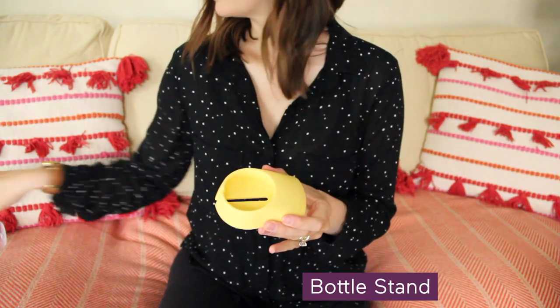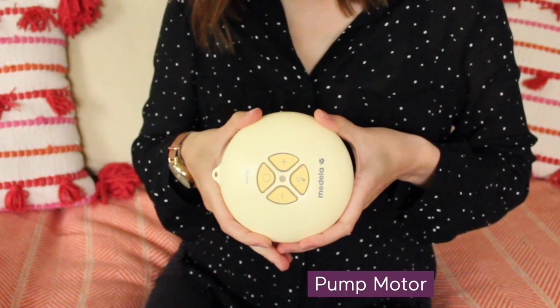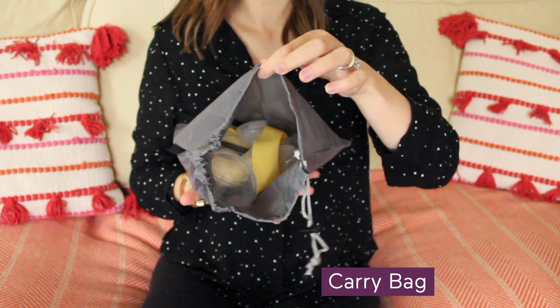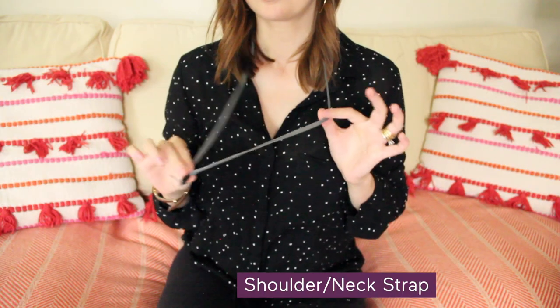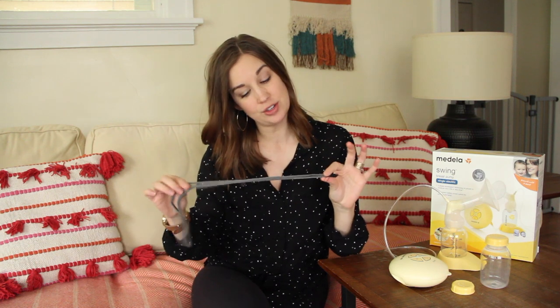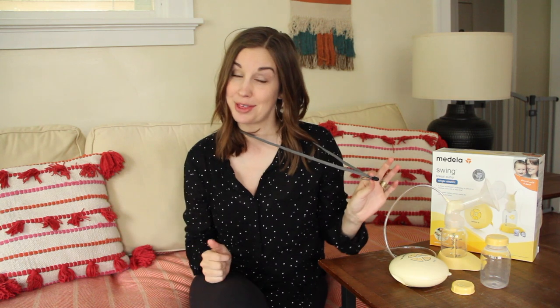It also includes a bottle stand to help prevent spills, the breast pump motor, the tubing, a little carrying bag to carry it all with you, and a shoulder/neck strap that attaches to the motor. I personally never used this stylish neck strap, but you might find it helpful to keep your pump out of the way.